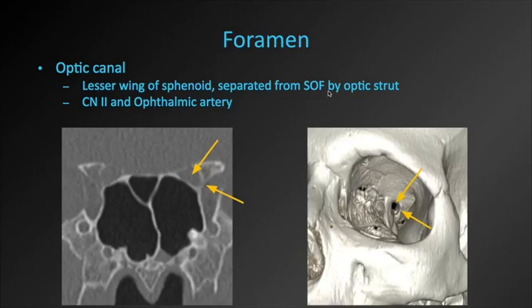Some important foramina in the bony orbit: first, the optic canal, which transmits cranial nerve 2 and the ophthalmic artery. The entire wall of the optic canal is made up of the lesser wing of the sphenoid. Here's our optic canal — this is called the optic strut, which is the lateral aspect of the lesser wing of the sphenoid, and that separates the optic canal from the larger, more lateral, superior orbital fissure. On a 3D reconstructed image, we're looking down the optic canal and can see the optic strut just laterally.